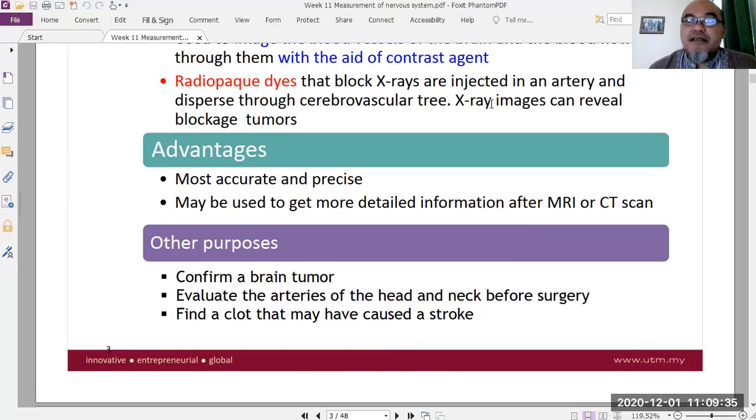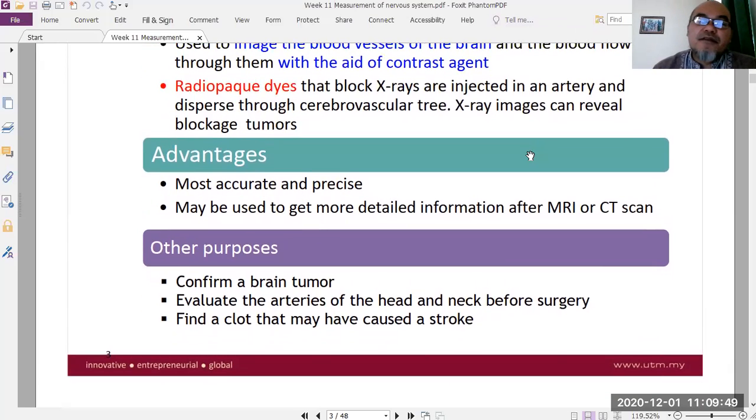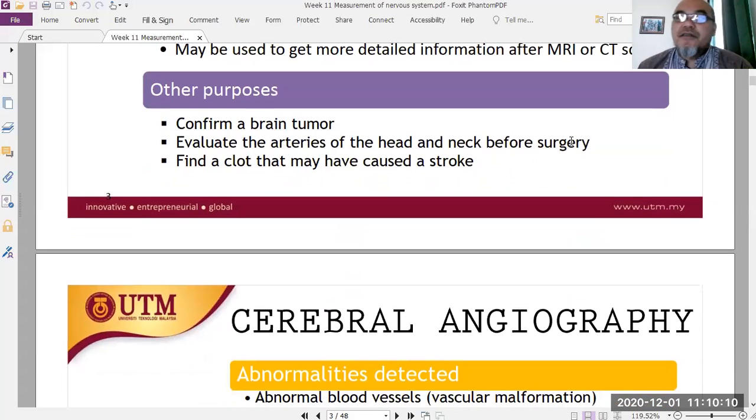For example, if I'm not mistaken, our current Minister of Health, Dr. Terawan, had one of his expertise before he became minister in doing this cerebral angiography, to detect any blockage of the artery, even in the brain. And not only that, he implemented an interventional angiography technique to spray an anti-clot agent to clean up the blood vessels. Although it is maybe not yet entirely accepted by the radiologists or by other neurologist societies.